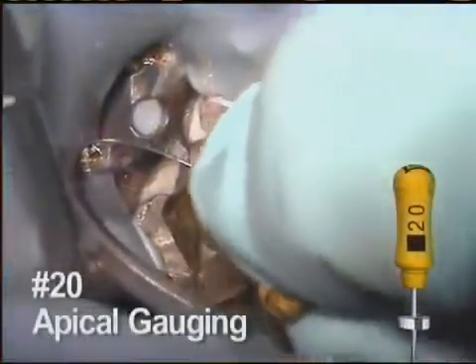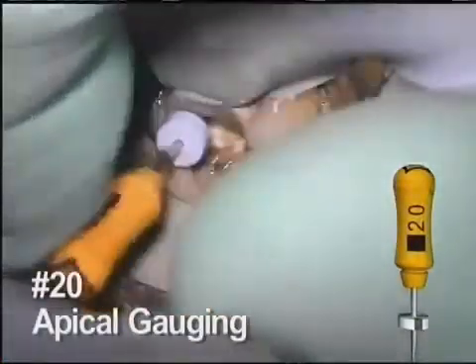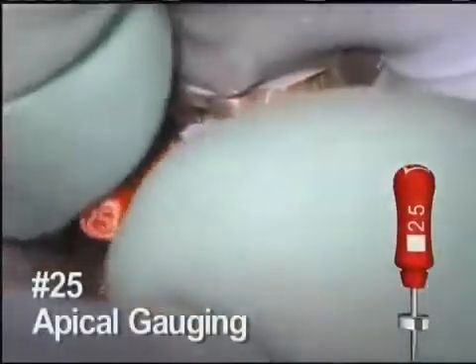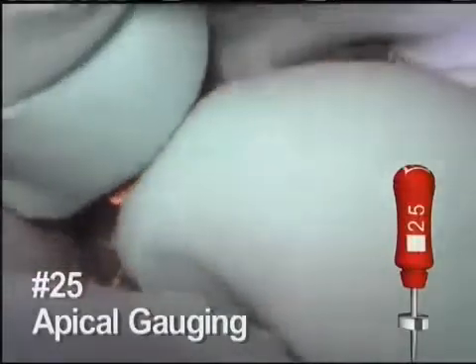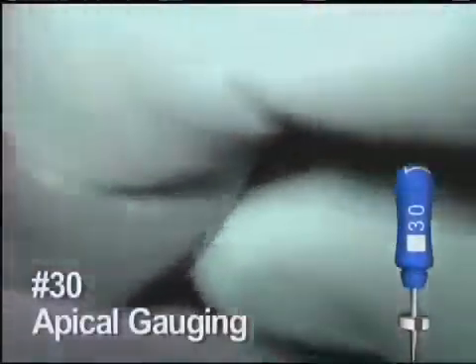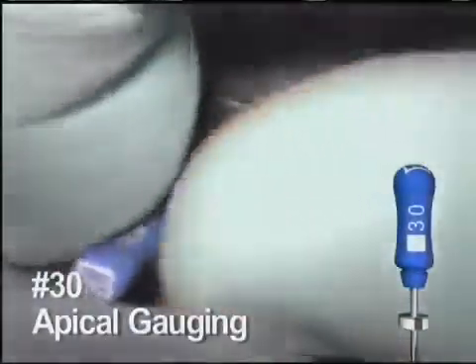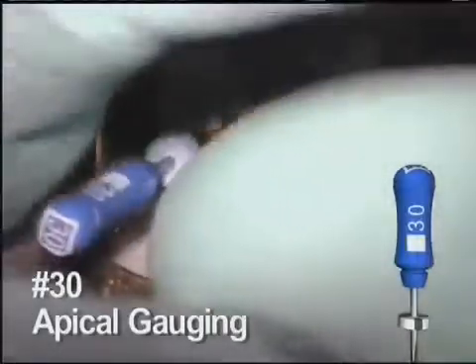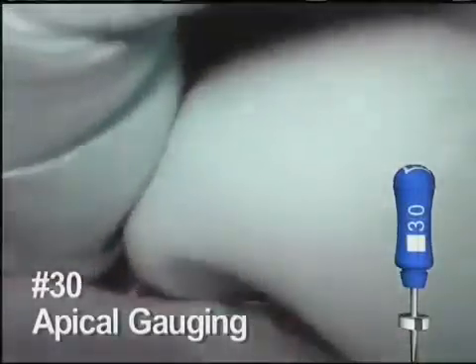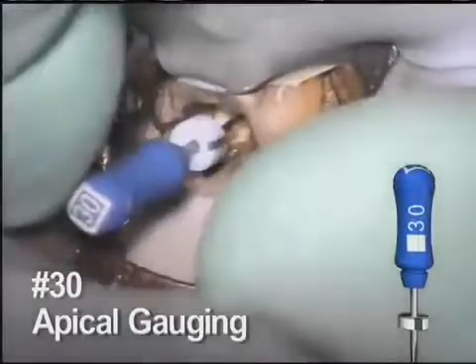Apical gauging with hand files is suggested to determine a final apical shape. In this canal, the 20 hand file fits appropriately. Although happy with the fit of the 20, for this example we tried the 25 hand file, which is also gently worked into the canal space. In this specific canal, it is too large and does not quite reach length. We also tried the 30 hand file, which takes more effort to get close to working length. Therefore, the clinical decision for this particular canal is to leave the preparation at a 20.